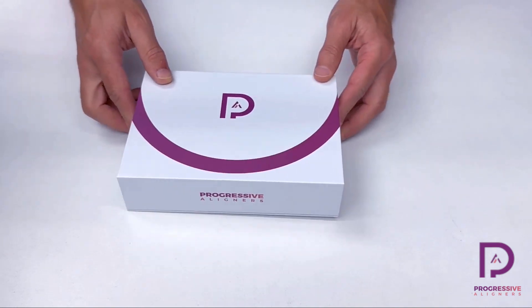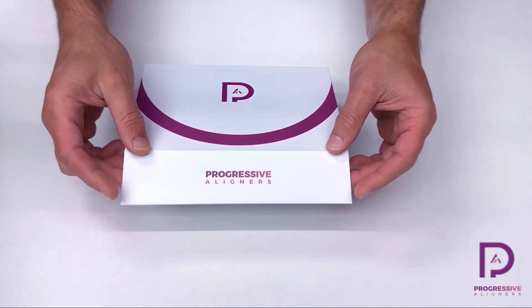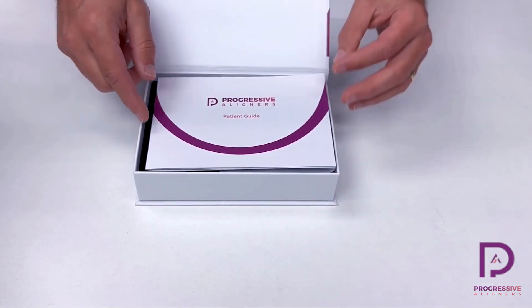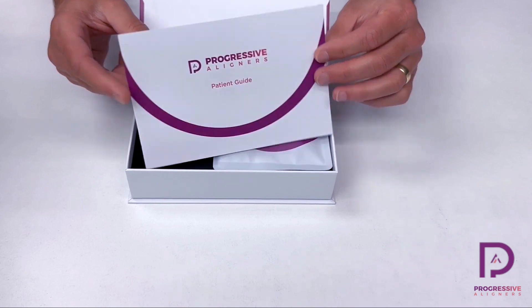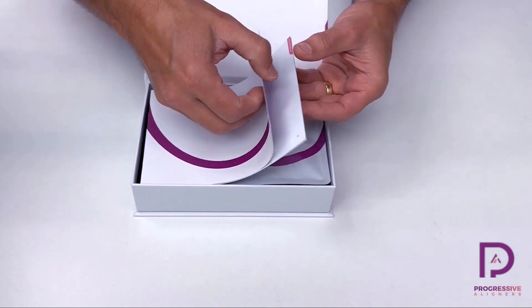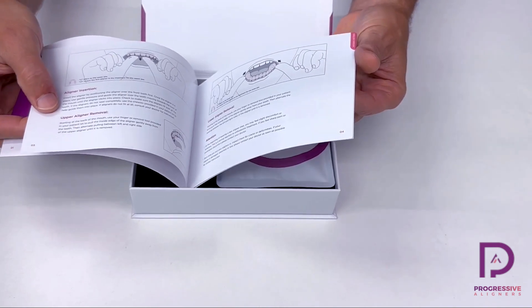It's a nice looking box, looks and feels great. It's got a nice little magnetic closed lid, and inside is going to be the patient guide. So they have their instructions with them — how to use the aligners, care instructions, how to take them in and out of their mouth.